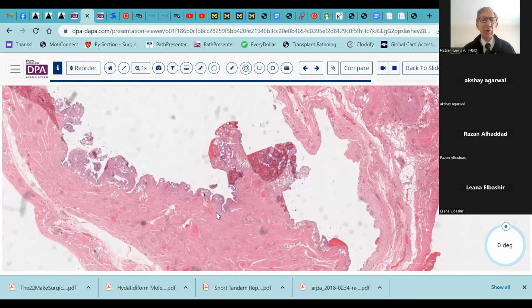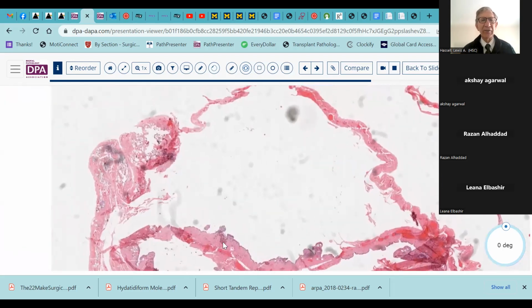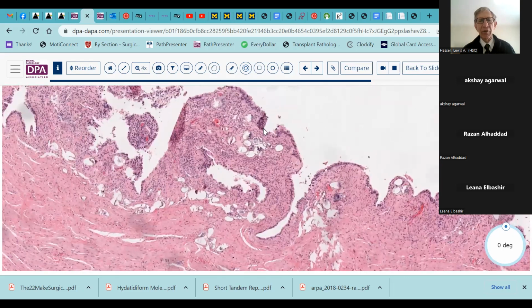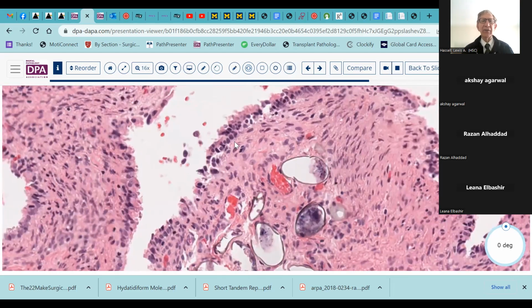At the same time, we usually think of schistosoma as being bladder associated and so forth. But any of these pudendal vessels and so forth could be sites where you could have the schistosomes developing or living and depositing their eggs. And as you can see here, the predilection is for submucosal spaces where there's the chance that they'll erupt and be excreted or allowed out back into the environment to develop further on the cycle, which is pretty much what happens when these occur in the bladder. So replicating that process and finding them deposited in a submucosal space in the GYN tract sort of echoes what their more normal pattern of deposition and escape into the next phase of their life cycle would be in the urinary tract.